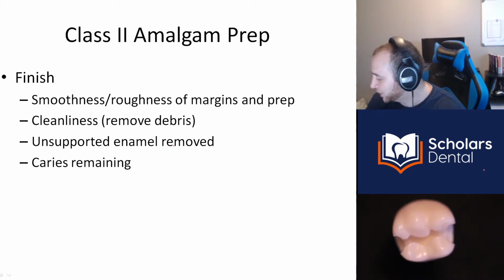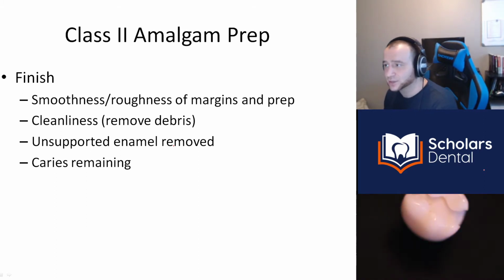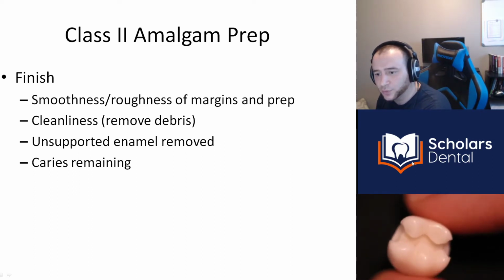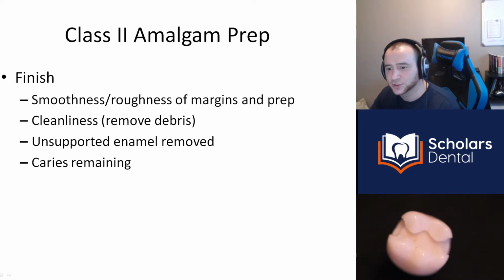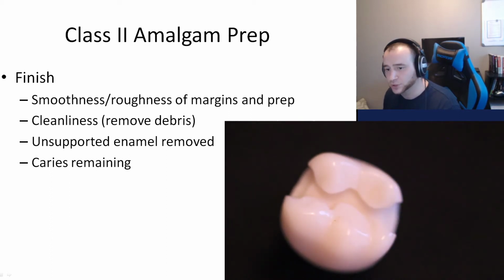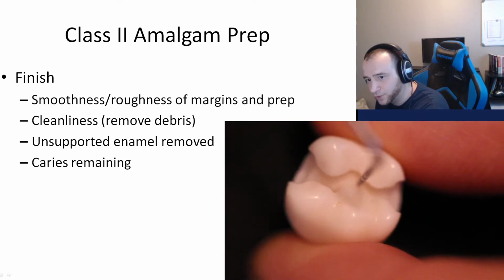You want to make sure your prep is smooth. So I think you understand what I mean by smooth. You don't want any roughness in your prep, any bumpiness. And there are ways to accomplish that. It requires control and patience in your preparation. So you can see this one is pretty smooth here, right? Look at the pulpal floor, it's not bumpy. It's smooth. It's passing smoothly.